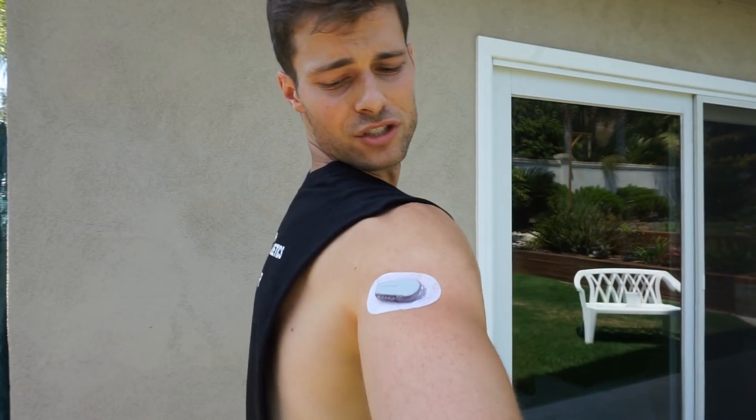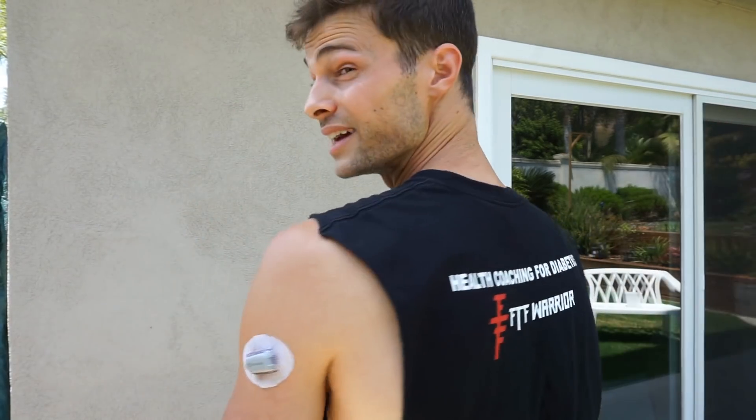So that is the Dexcom G6 sensor change — back of the arm, you can't even tell it is there. Check me out — rocking two Dexes right now. So that is the Dexcom G6 arm sensor change. I will probably try a lower back one later on — see if you guys want instruction on that. Hope you guys found this helpful. If you did, drop a like. Let me know what else you guys want to see as far as diabetes education goes, let us know if you have any fitness or nutrition questions, because like I usually say, we are diabetes health coaches and we are here to help you guys. Hope you have a great rest of your day and keep up the fight.